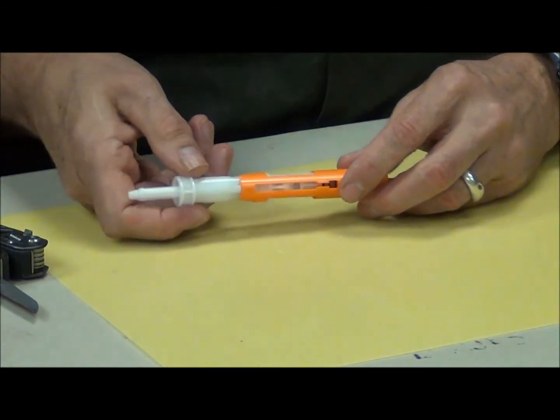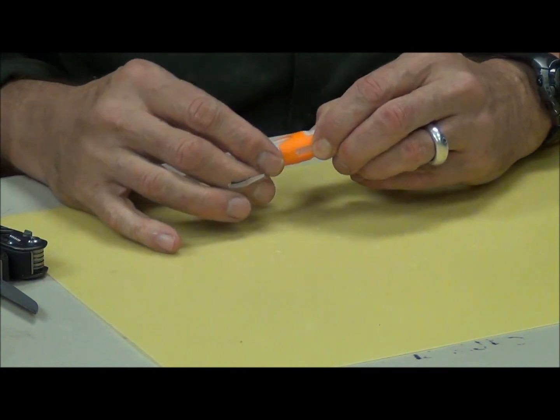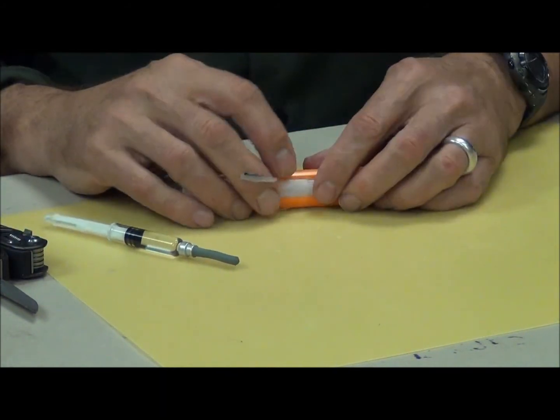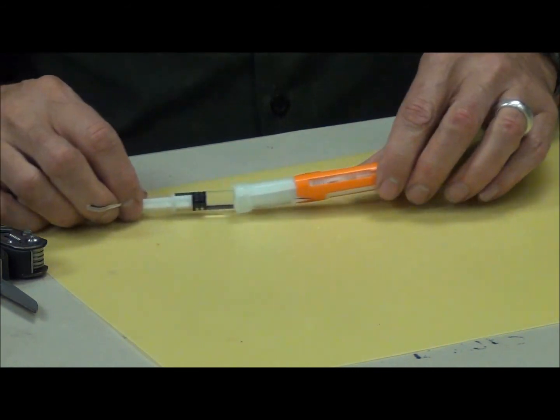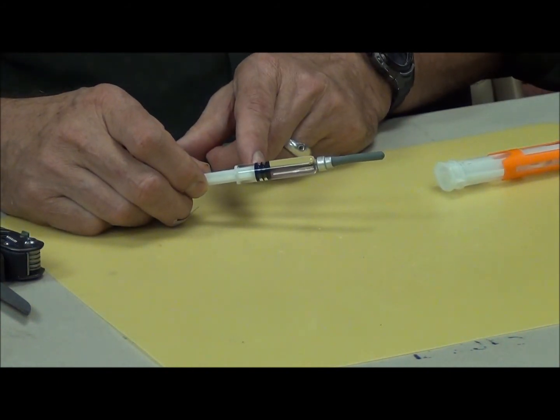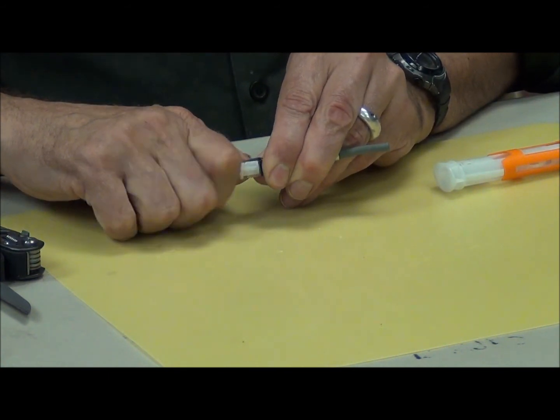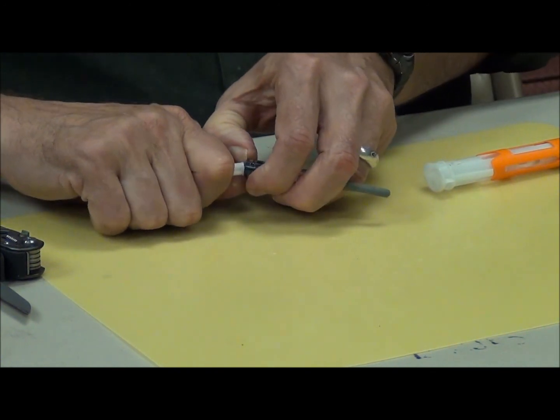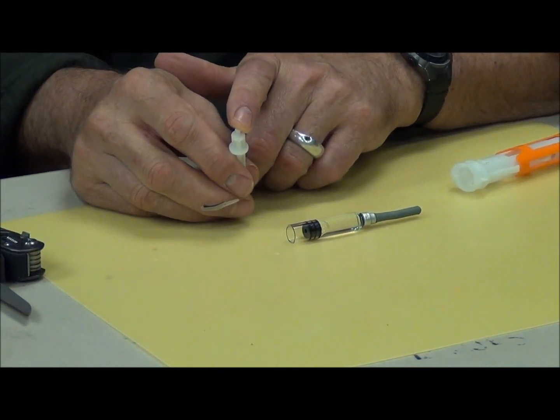And you'll notice that the epinephrine syringe is still held in the white plastic here. So we'll have to remove this by squeezing on the clips and it will slide out. Squeezing right here on the sides of the syringe. Let's pop this right out. Unfortunately, in this new syringe, this is no longer a threaded attachment. It's a friction attachment, so we have to carefully back the stopper out until the black part is at the edge of the glass, and then lever out to remove this part of the syringe.